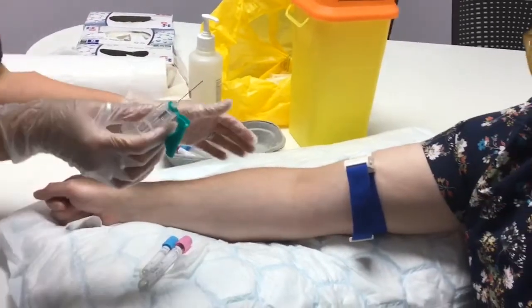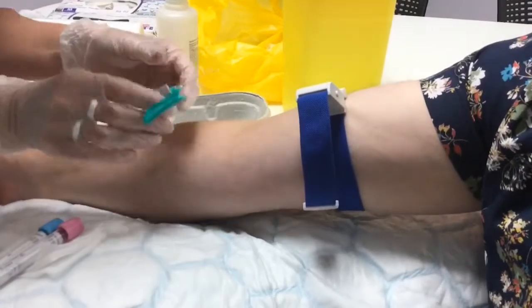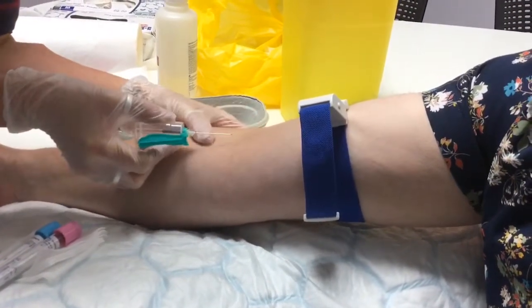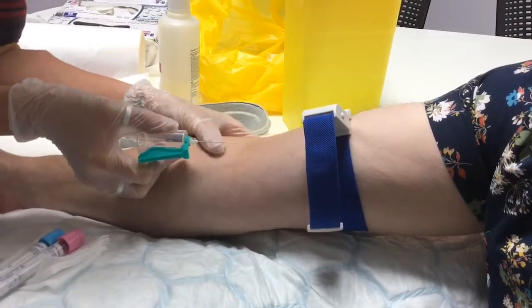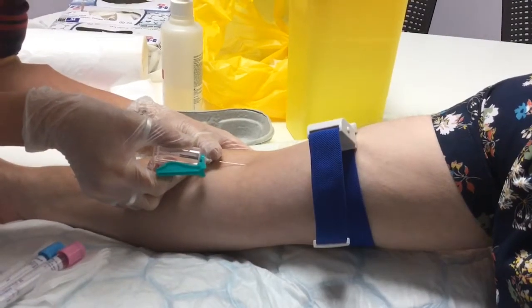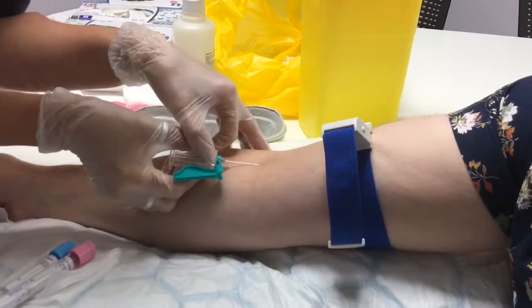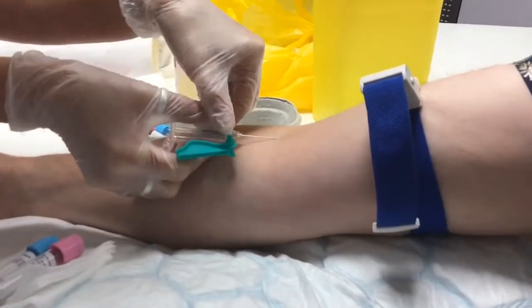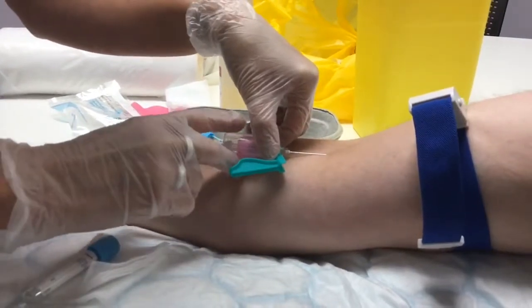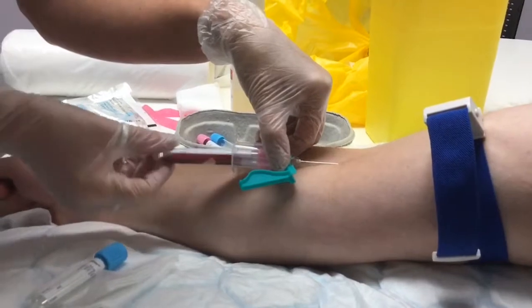I'm going to stand up to do this because I find that easier. I've got my gloves on so I can touch the vein. Just a sharp scratch going in there. And we get a flashback — you can see we've got a flashback there, lovely. I swap hands, then I'm going to put my bottle on — put your fingers like that and push the bottle, and you should find that the blood comes out nicely. Lovely red blood — beautiful.